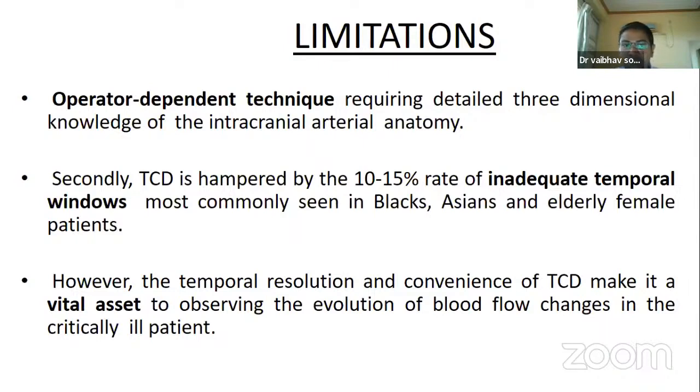Some patients have osteopetrosis or thick bone. So even after increasing the power, we are not able to get a proper temporal window, and in those patients TCD is not able to give proper benefit. This is most commonly seen in Blacks, Asians, and elderly female patients, and most Indian patients as well.